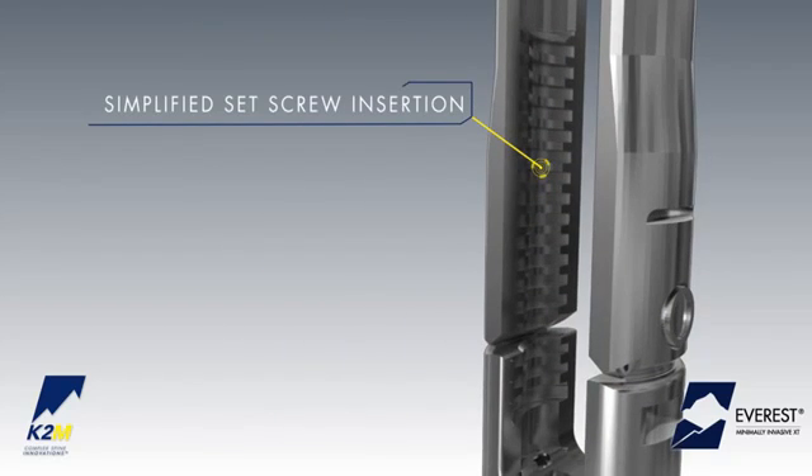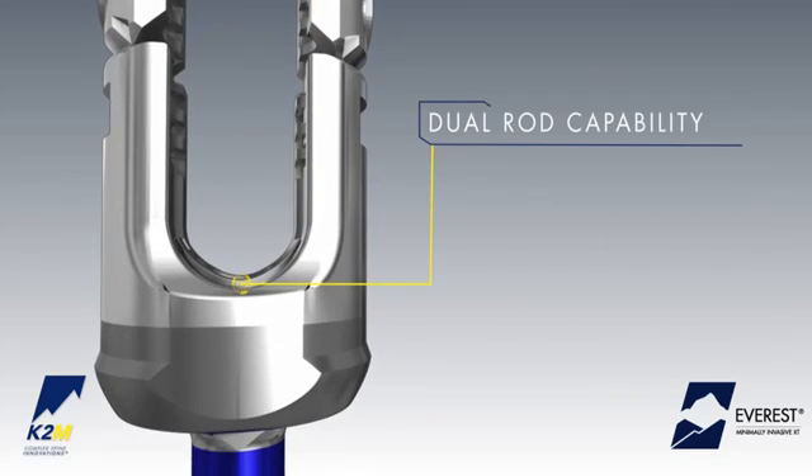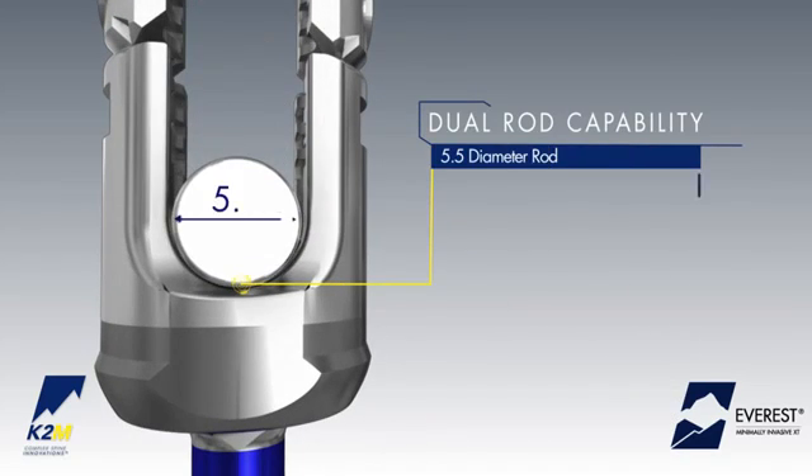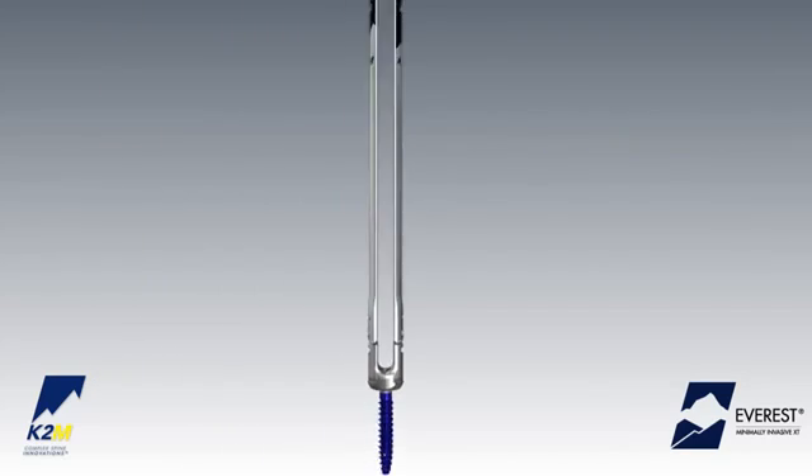A simplified approach to set screw insertion with a square thread design facilitates set screw introduction while reducing the potential for cross-threading, and dual diameter rod capability, allowing for the use of 5.5 and 6.0 diameter rods.